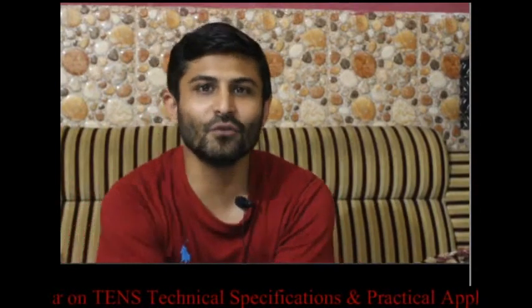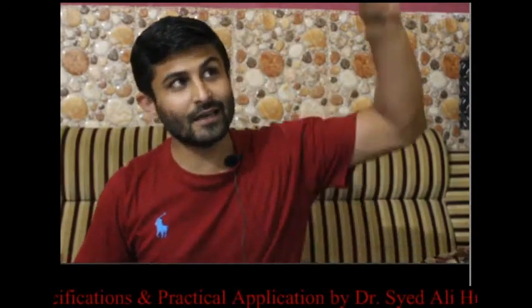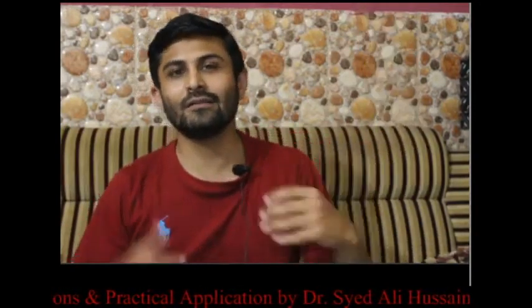The last question is, sir, if we use low frequency and high intensity mode of TENS in cancerous cells. What I mean is, high intensity is basically maximum bearable. You need to classify things like high frequency and low intensity. Low intensity means minimum perceptible. So low frequency and high intensity means maximum bearable. जितना patient easily बर्दाश्त कर सकता है, ये है maximum bearable.